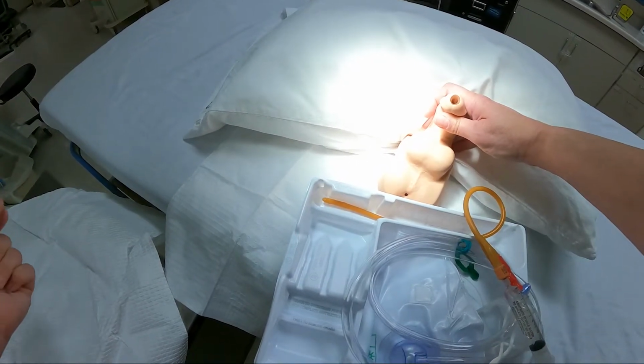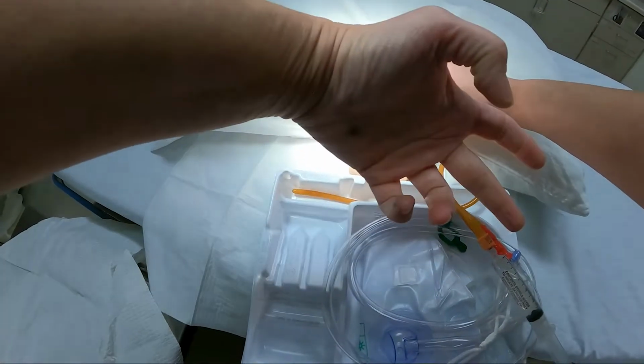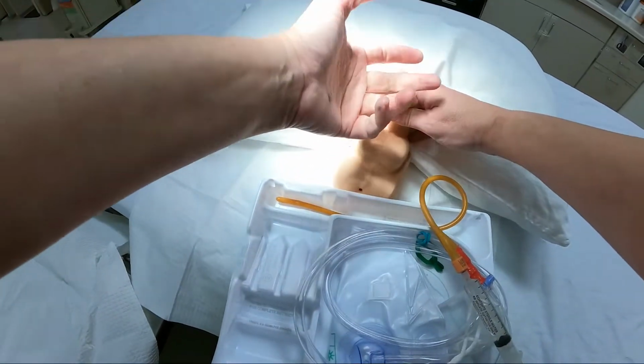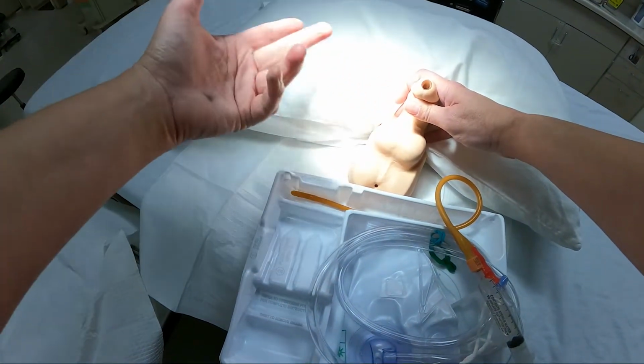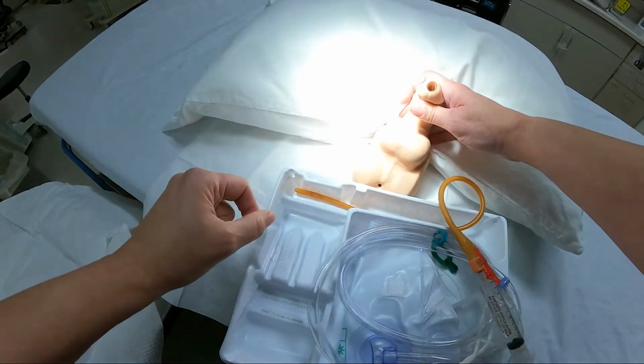I think we do have it in the Pyxis. So if you use the Urojet, you can either put it in there, or it has a syringe tip on it. You can put that gently in the meatus and kind of give a little bit. You don't want to put the whole 60 cc's or 30 cc's that way, but a little bit. Plus, you want to make sure that you're well lubricated.